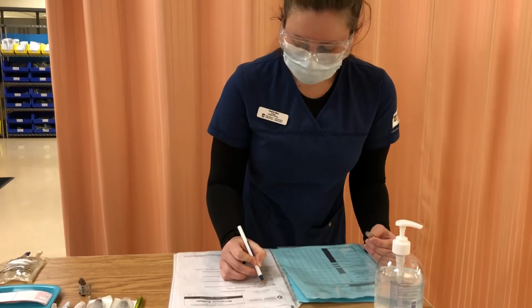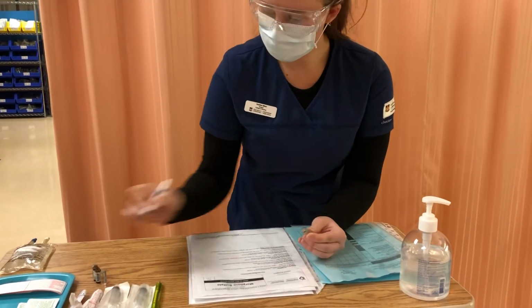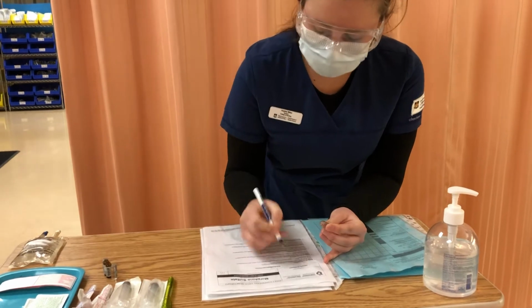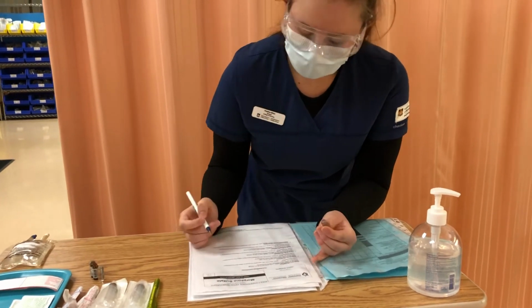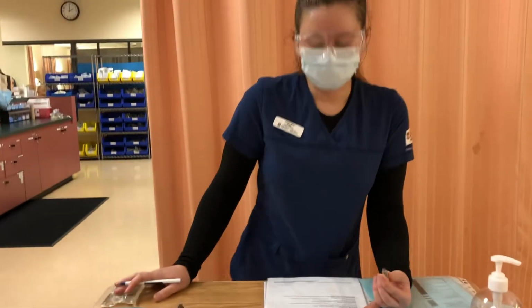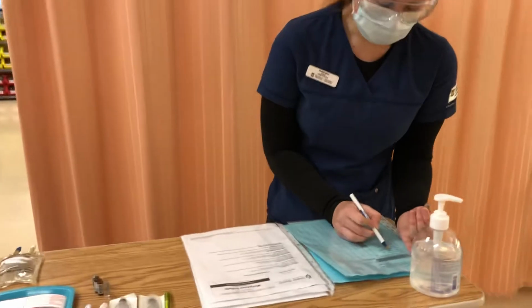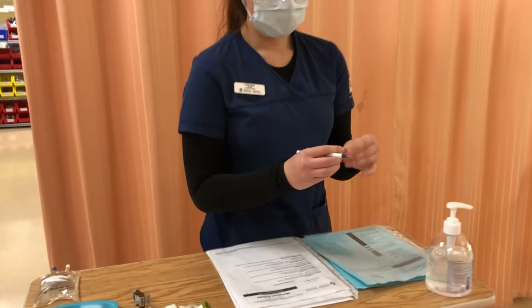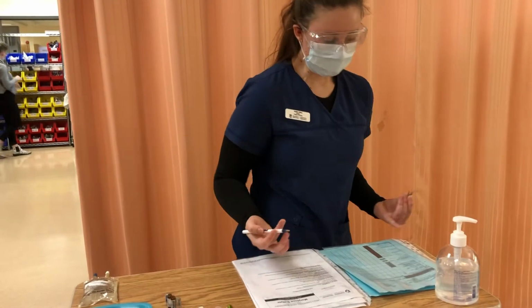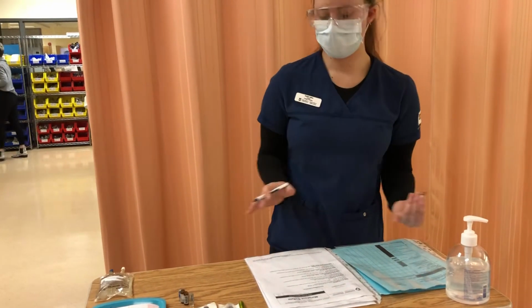I will be drawing up 50 milligrams, so 10 milligram per milliliter, 1 milliliter ampules. So this is 1, 2, 3, 4, 5, 10 milligram per milliliter. This is a 1 milliliter ampule. I will then be diluting with 45 milliliters of normal saline for a final volume of 50 milliliters and a final concentration of 1 milligram per milliliter. So this is to be given IV, and these can be given IV. This is due now, so I'll be preparing and giving it now with a PCA dose of 1 milligram and a lockout interval of 5 minutes. So those are all good to go.